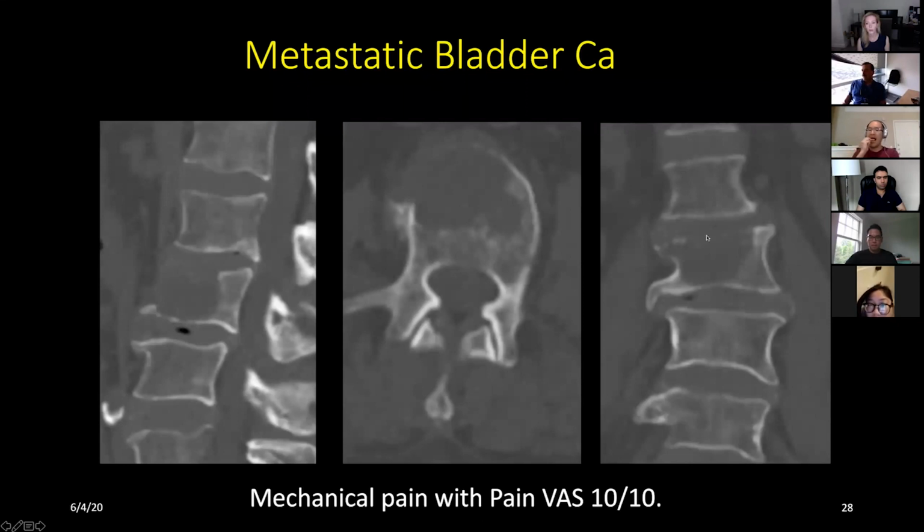There is really no collapse of the vertebral body, but definitely there is involvement of more than 50% of the vertebral body as such. So we'll get a score of 1 as such. And if you are a purist, there is some lateral involvement, paraspinal involvement, so you may give it a score of 1, or I just gave it no posterior lateral involvement, so gave it a score of 0. So total score came out to be 9.